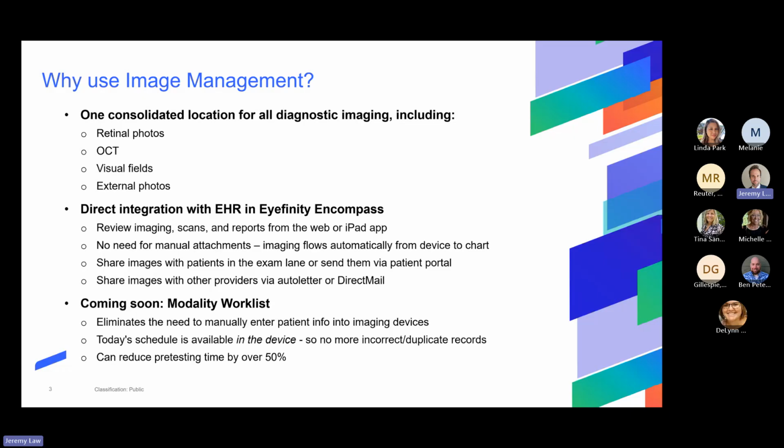Now, I did mention we have a new feature coming soon. It's a feature called the modality worklist. That is a mouthful, I will be the first to admit. But it's a term we didn't come up with. This is a standard term you may have heard of before when it comes to imaging devices. Essentially, this is the ability for your staff, or you, if you're operating the imaging device, to just skip all the busy work of manually entering the patient's information into the imaging device.